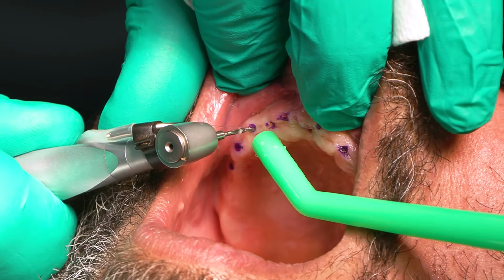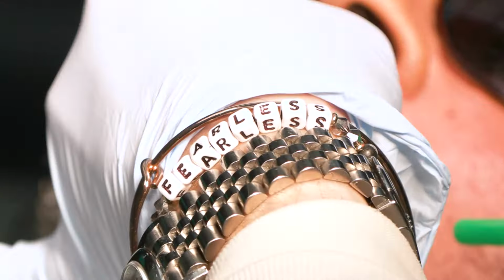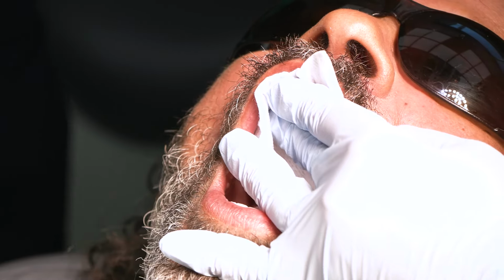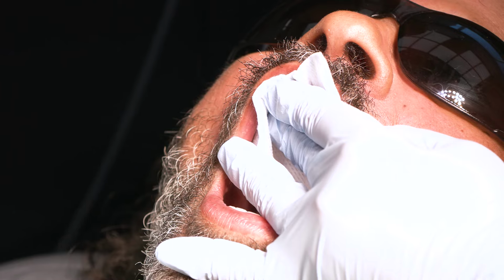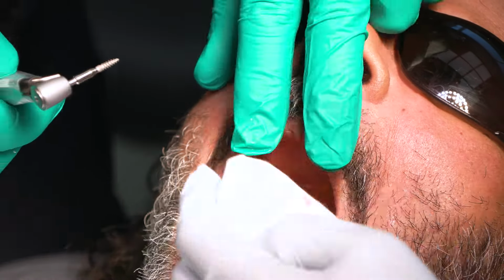Little trick, if you place a few holes at the same time, you can keep your handpiece in the same parallel position to parallel the implants. Sometimes if you do one at a time, it gets a little harder to parallel. So we're going to go ahead and put the first one in.